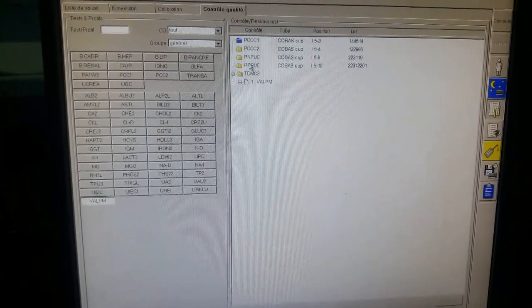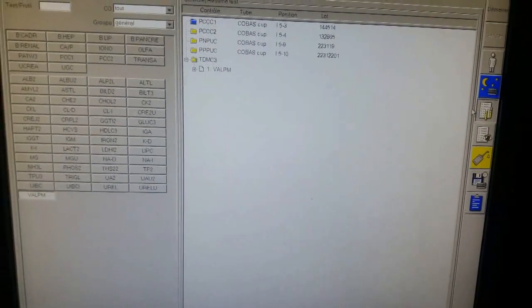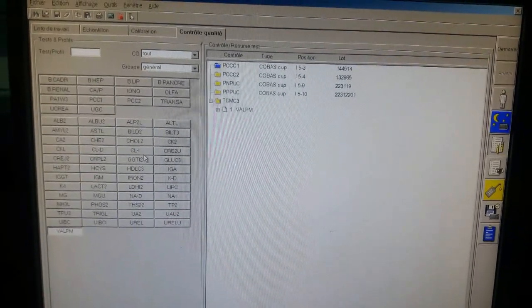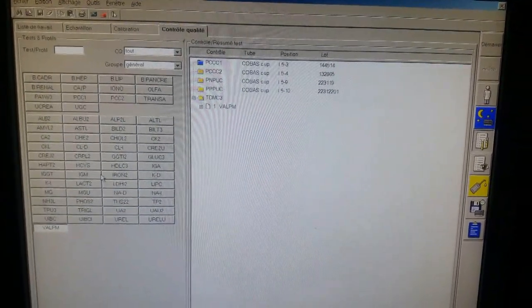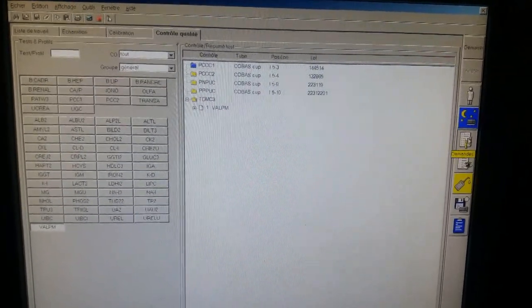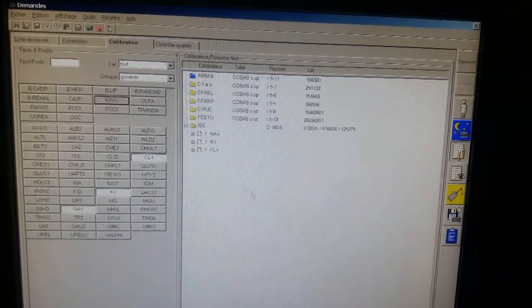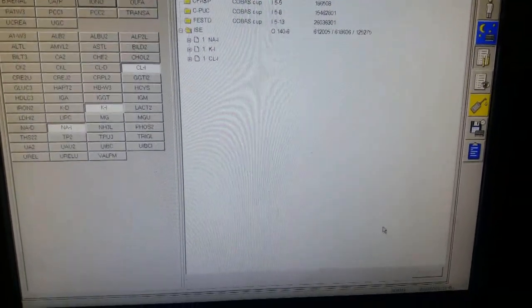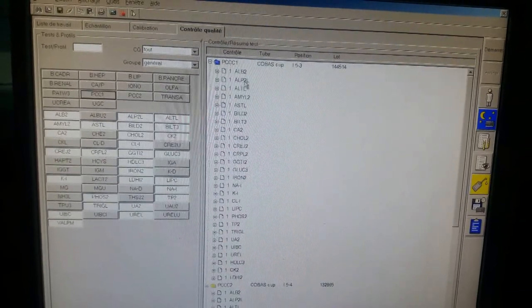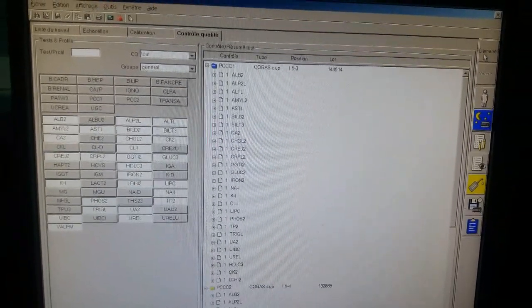Chaque début de journée, après la maintenance, il faut impérativement étalonner les paramètres de l'ionogramme. Puis passer le contrôle normal et pathologique pour tous les paramètres biochimiques, tels que glycémie, créatinine, gamma-GT, CRP, etc. Pour ce faire, on appuie sur l'icône demande pour calibrer l'IONO — demande et calibration. On appuie sur IONO pour calibrer et on enregistre. Puis on passe pour le contrôle de qualité : on appuie sur PCC1 et PCC2. Tous les paramètres à contrôler figurent sur cette liste, et puis on enregistre. Et on démarre les analyses.